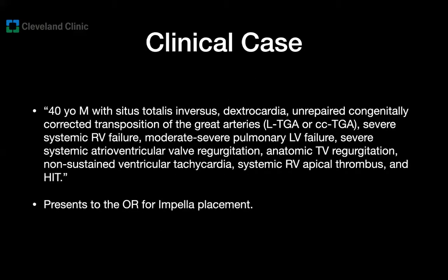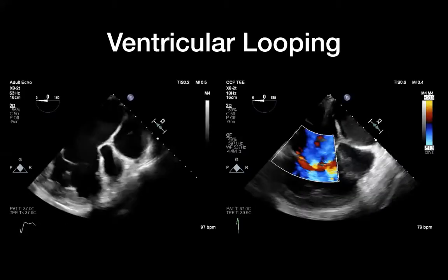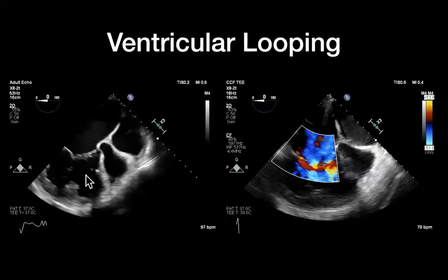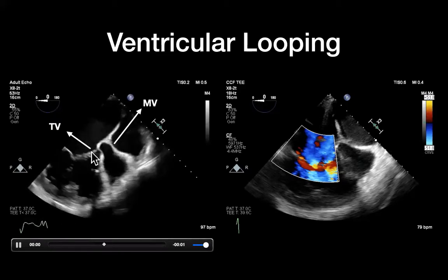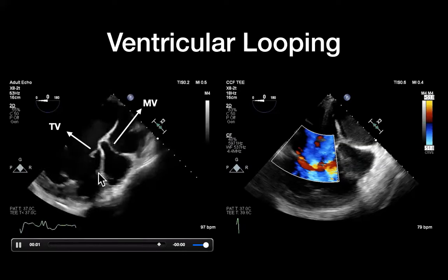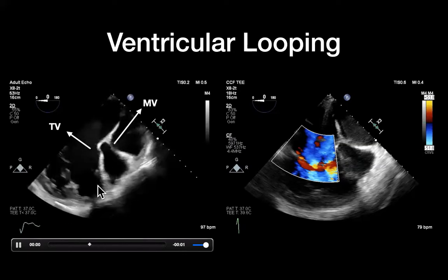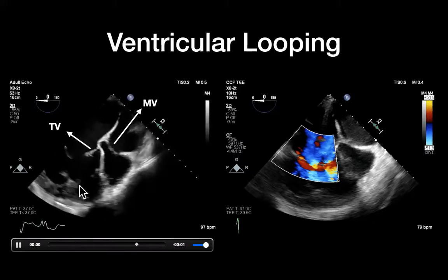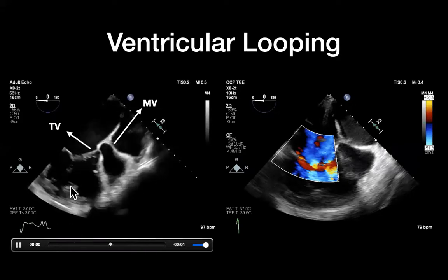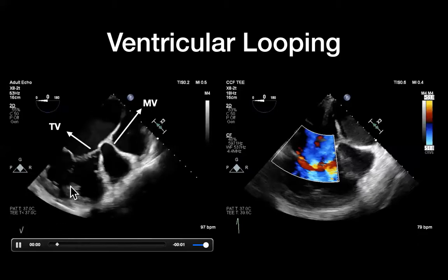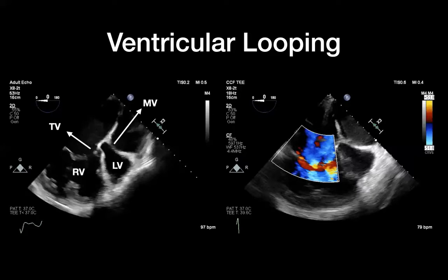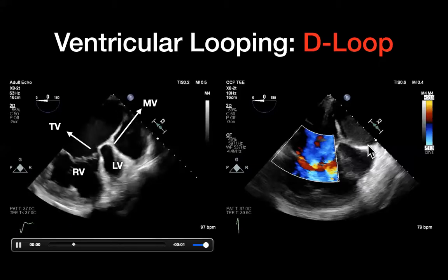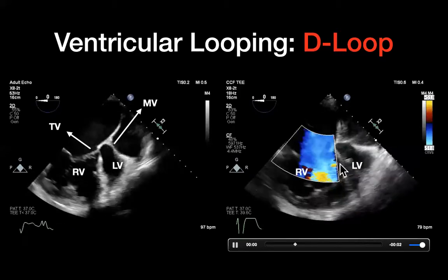Let's go back to our case and apply this concept. The clip on the left shows that one AV valve sits lower — more towards the apex — than the other, so that one must be the tricuspid valve and the other the mitral. Additionally, there appear to be chordal attachments to the septum, a moderator band, and the anterior papillary muscle of the tricuspid valve — all features of a morphologic right ventricle, which is located on the right side of the patient due to D-looping. The clip on the right shows that the jet of regurgitation corresponds to tricuspid regurgitation because this is the right ventricle.